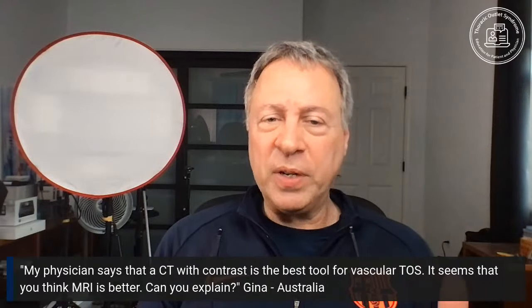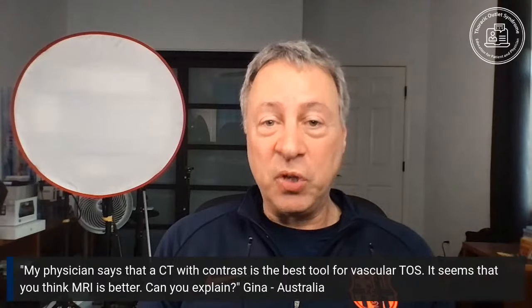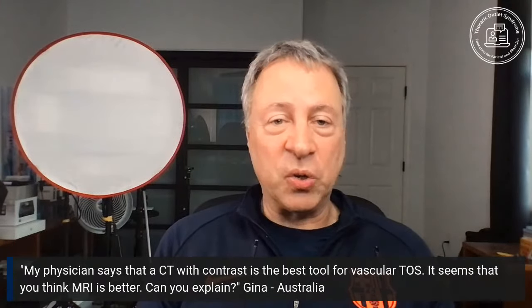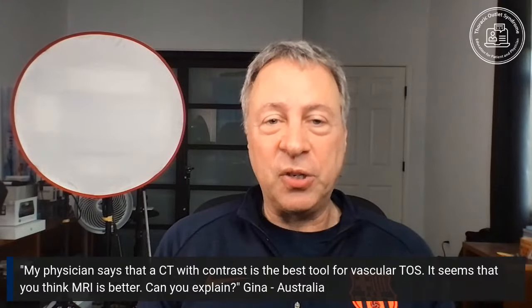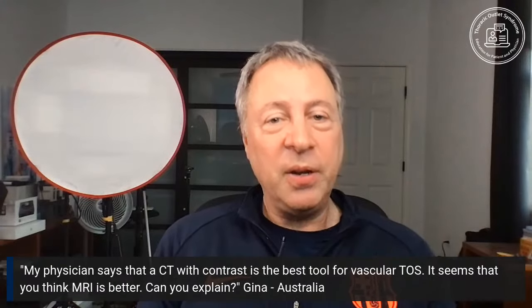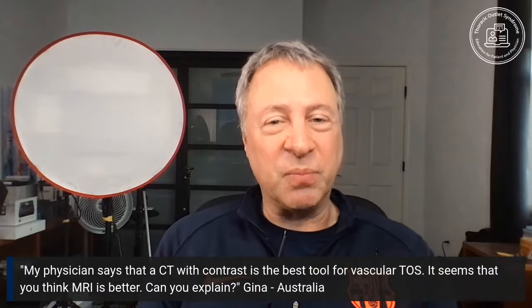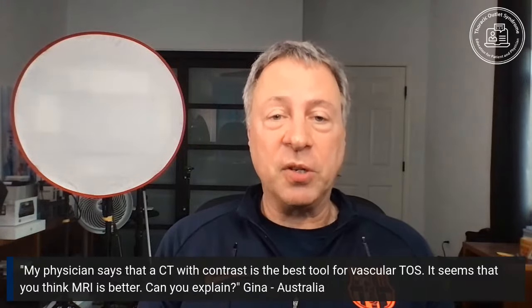So for them, it's oftentimes easier to get a CT angiogram because the bones are white, the blood vessels are white, the lungs are black. Everything else is pretty much medium to dark gray. So it's a very stark image. You can see the bones and the blood vessels and pretty much nothing else. For some docs, that's easier. You really see very sharp images.